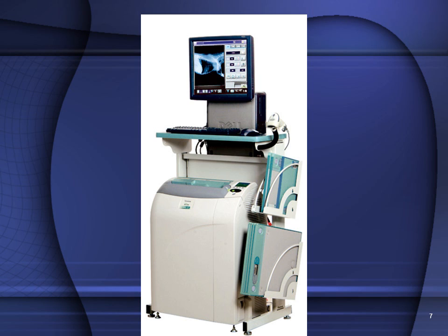So the cassette is placed into the reader, and the reader erases the cassette so the chip or the cassette is ready for the next use, literally in seconds. And the data is transferred to computer, and the image then appears on a high-resolution screen where it can be interpreted or analyzed by the radiologist.